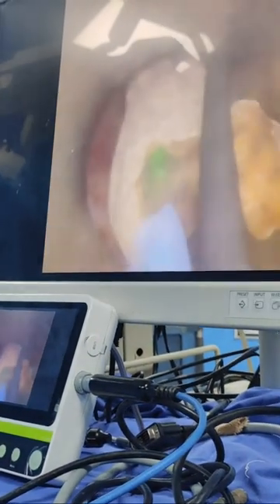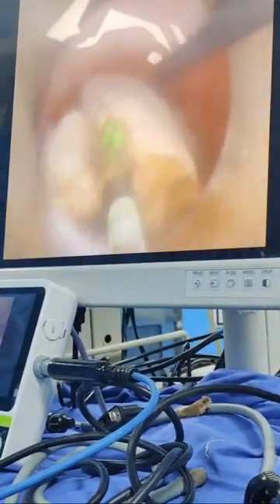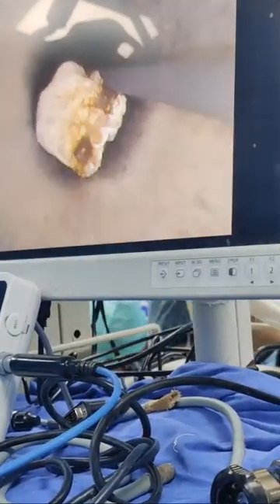So just see the fragmentation. We are using 550 fiber. The stone has gone into the bottle.